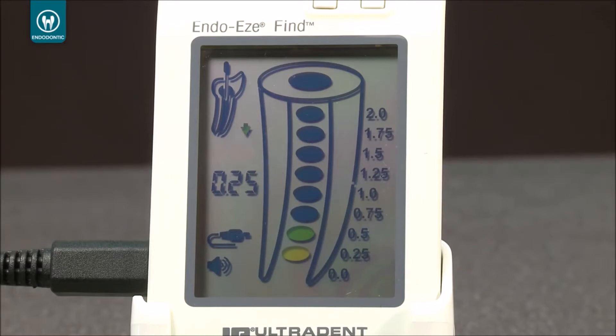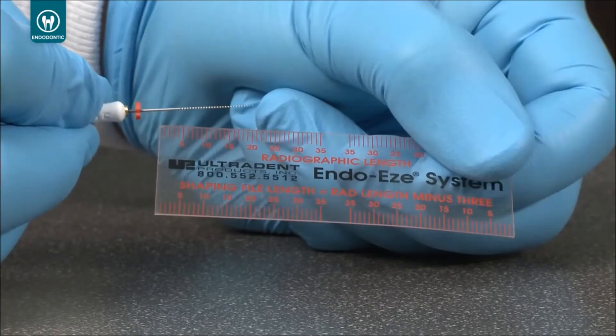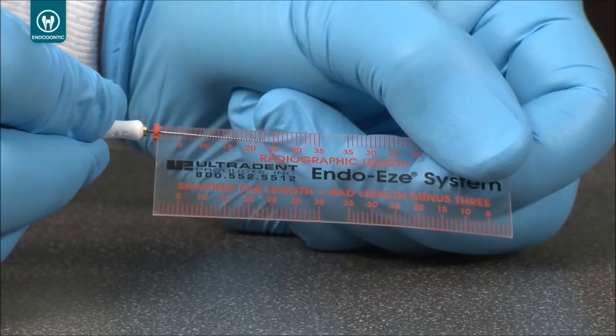Numerical readings appear under the tooth icon. When the Find unit returns a numerical reading of 0.0 accompanied by a constant audio tone and the first red dot has appeared in the schematic, the tip of the file is at the apical foramen. Use cotton pliers to push the stopper down to the reference point. The working length for the canal can now be established.